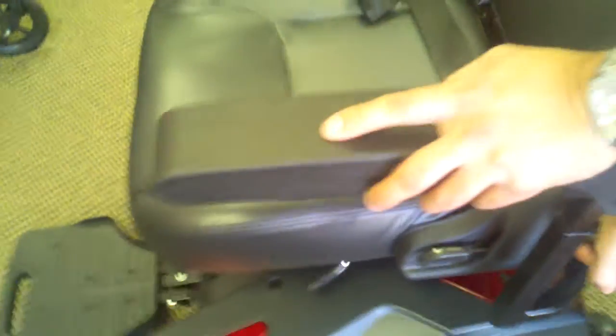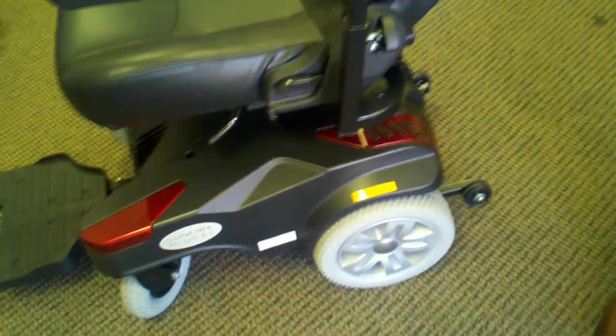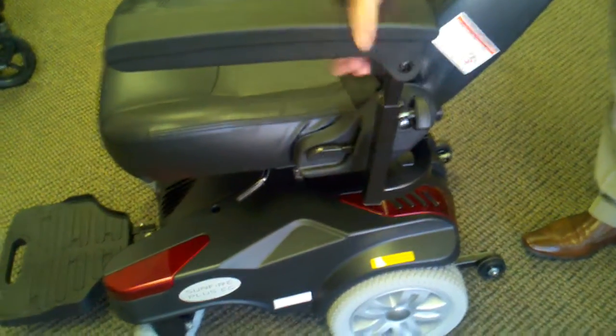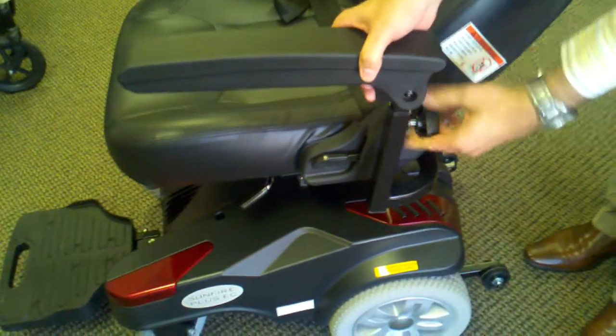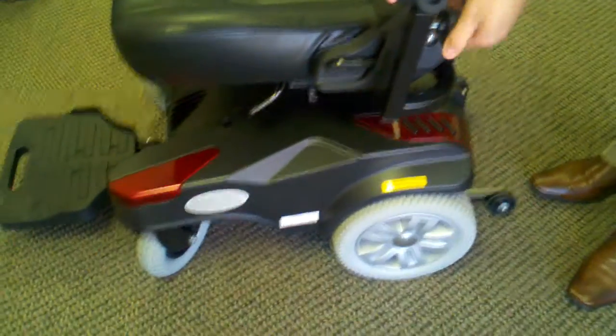And these are flip back, which is important, and easy transfer. Yep, and you can adjust the set screw right here on the armrest, so you can adjust the height of that, or the pitch of that, excuse me. It also does have a set screw here, so you can. Oh, so you can move that up and down, right? Yep. Actually, it's what would you call an infinite? Just because there's not any actual pin slots. Okay, it's just a set screw, so it's more of an infinite position.